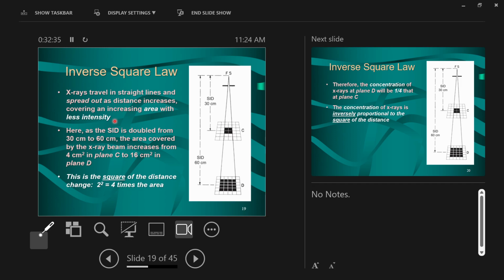So you turn your light bulb on, and the light moves some distance away from the light bulb, and you pause time, and then you admire the space that the light has covered, the area that the light has covered in that time, okay? All of the light that you emitted from that light bulb at that moment in time will be within some area, yeah? Then you start time again, and the light will move further away, covering a larger area, okay? The same amount of light that covered that small area will now cover a much larger area.